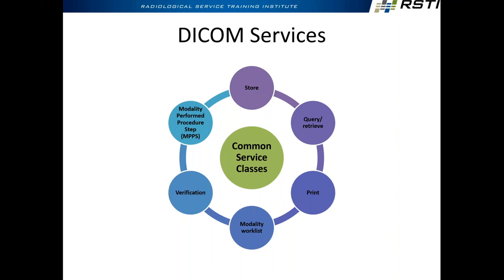That would be the ADT server. If it's a broker that's converting, then yeah, your ADT would all be part of this. Exactly. The thing about ADT though, ADT is not diagnostic. So ADT, what he's getting at is HL7. The HL7 data is more clinical data and billing information, just Health Level 7 for admission, discharge and transfer. That's not DICOM, so a broker would convert HL7 data to DICOM. So technically, the work list provider would be the broker, because it's the one that provided that conversion. Does that kind of make sense?